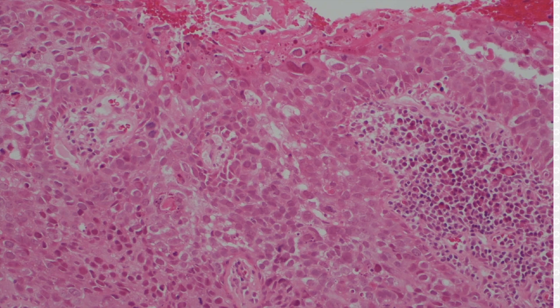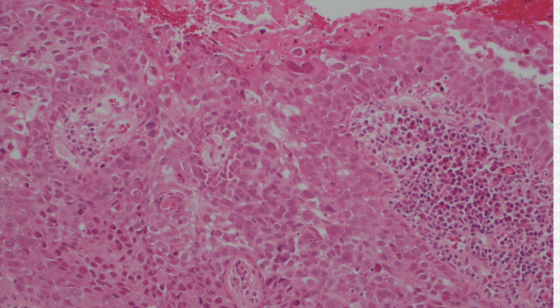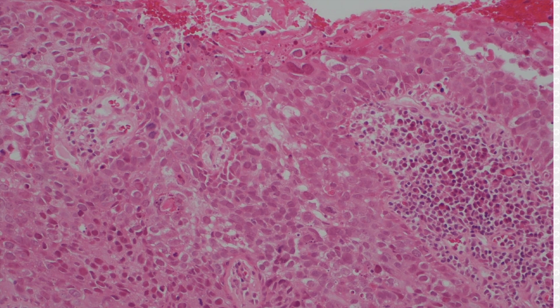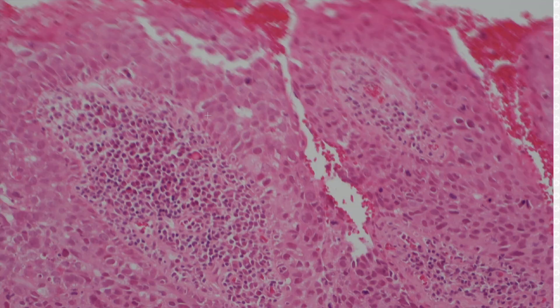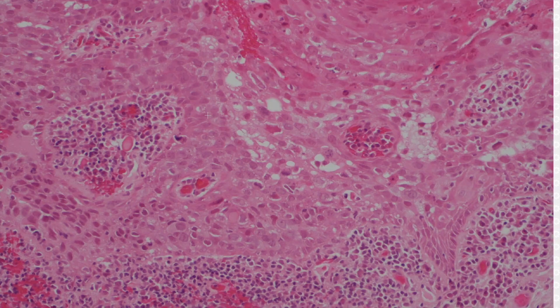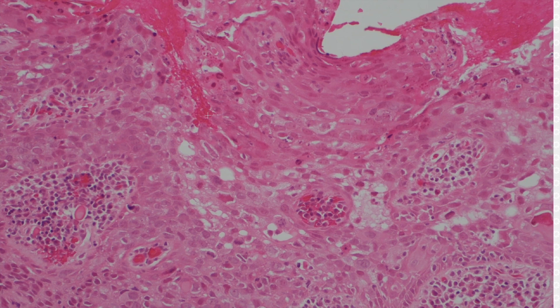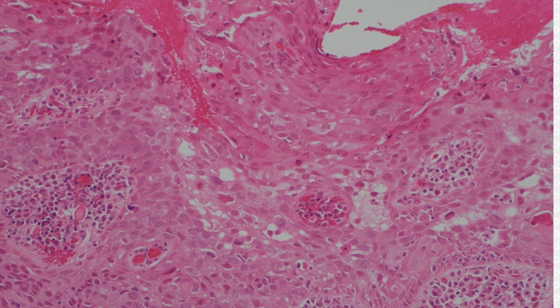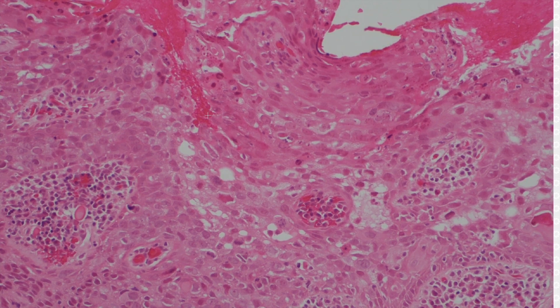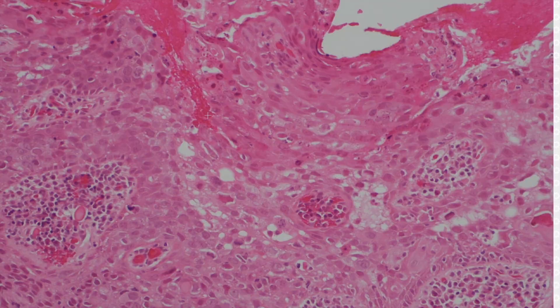I used to stain it sometimes, and if it really is sebaceous differentiation, then I would say that I see in situ sebaceous carcinoma like several times per week — and that just seems unlikely to me. So I've come to accept that you can get lipid bubbles in some squam in situ. I don't know if that's right, but that's the way I regard it.